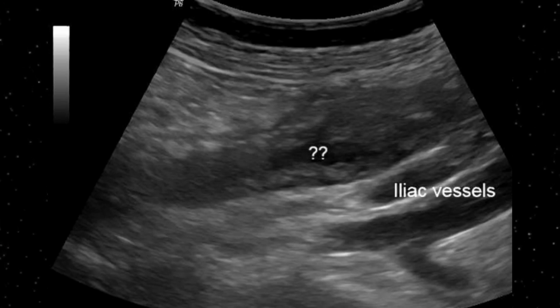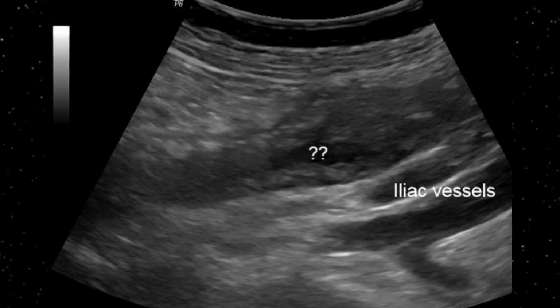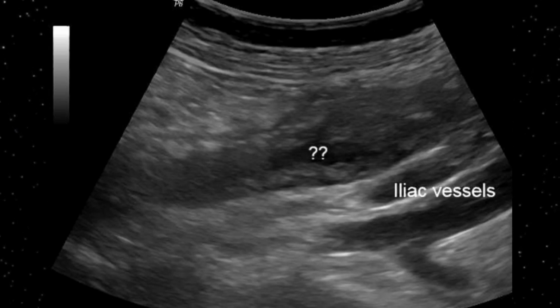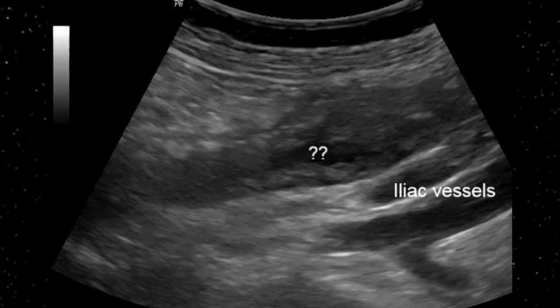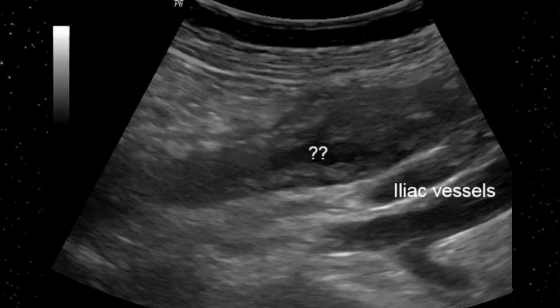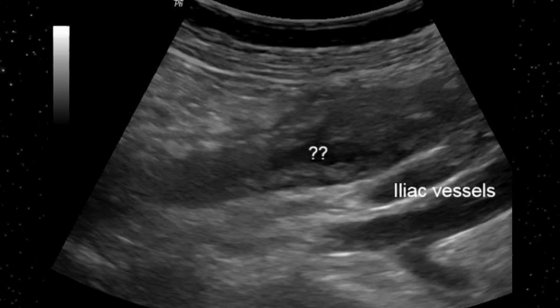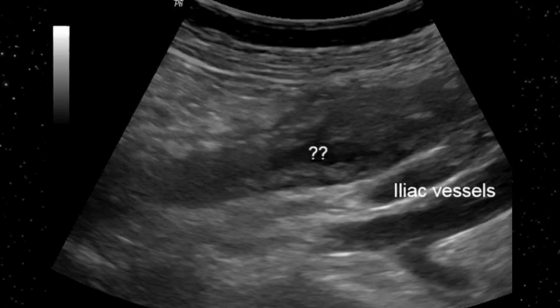But if it is partially obstructed, as I mentioned earlier, and you have seen the previous image, you can see that there was partial flow in the periphery of the thrombosis. So that would be partial, but in this case this is a complete luminal thrombosis.